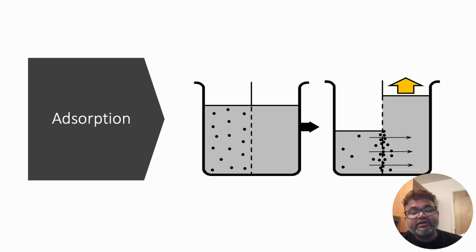These are filters attached to the CRRT machine which work by adsorption. The molecules targeted for removal bind on the membrane, and after using it for a particular duration, you can just throw the filter away, so the toxins are removed from the body.